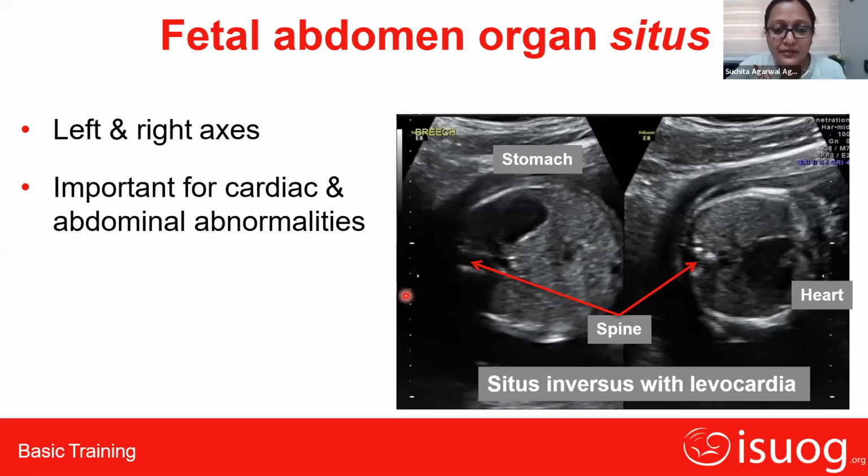The fist represents the fetal head? Sir, actually, these knuckles will represent the head, and this will be the back, the spine, the dorsum of the hand.